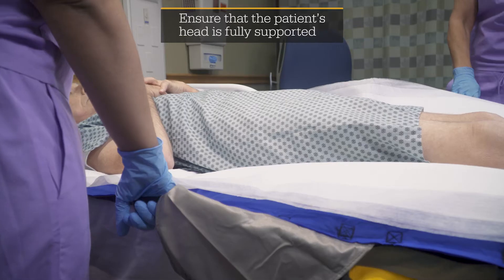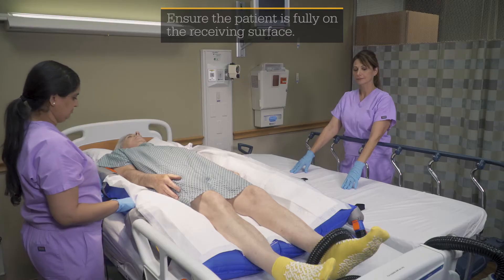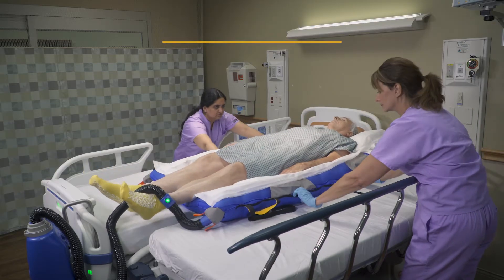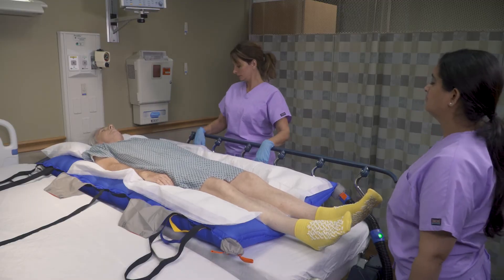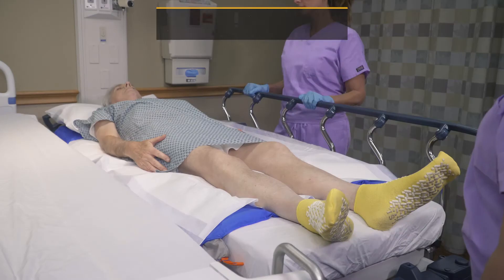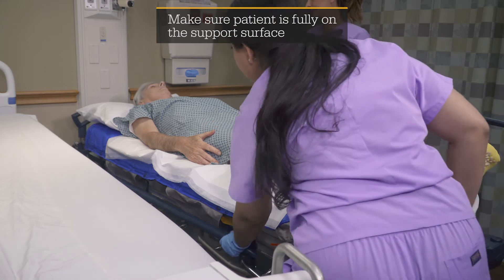Turn on the air pump and allow the glide sheet to fully inflate. Gently glide the patient to the receiving surface, with one health care provider holding the patient in place. Turn off the air pump when the glide sheet is fully deflated, slightly separate the support surfaces, and raise the rail.